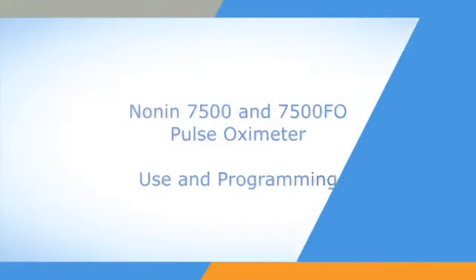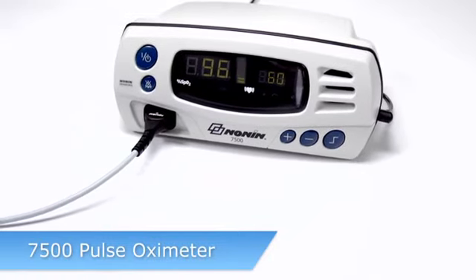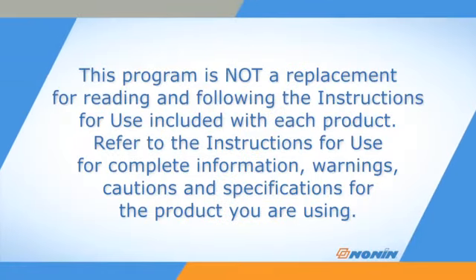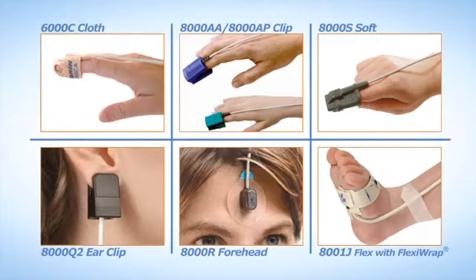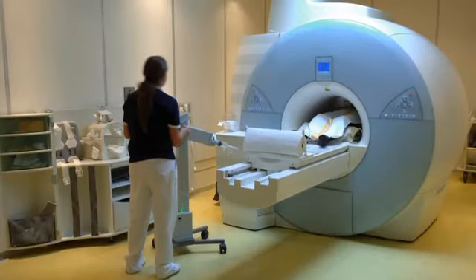This short video shows how to properly program, connect, and operate Nonin model 7500 and 7500 FO pulse oximeters. The 7500 pulse oximeter model is designed for mobile and tabletop oxygen saturation and pulse rate measurement and is compatible with the full range of PureLight sensors from Nonin Medical. The 7500 FO model is specially designed for use in magnetic resonance imaging environments.